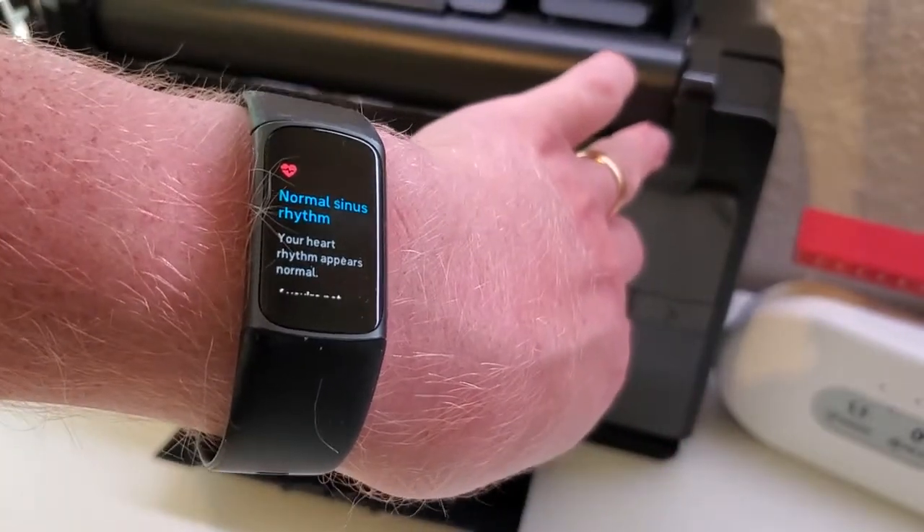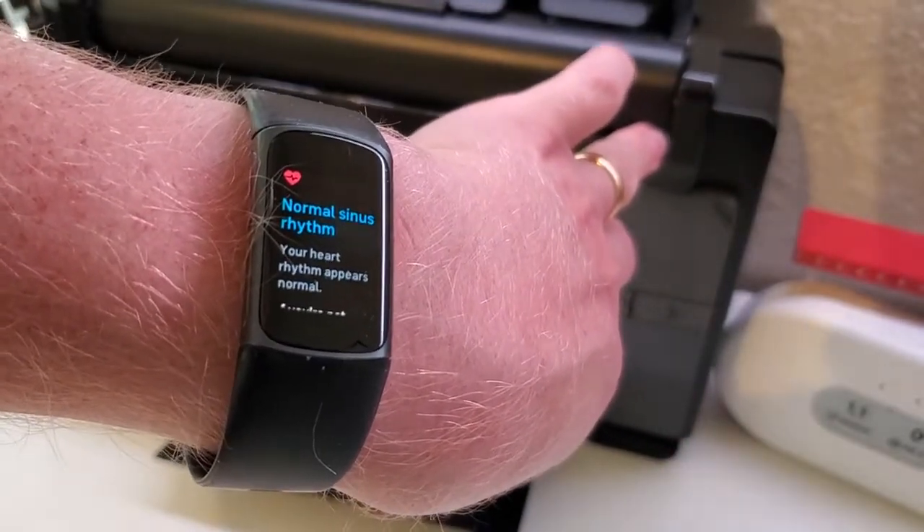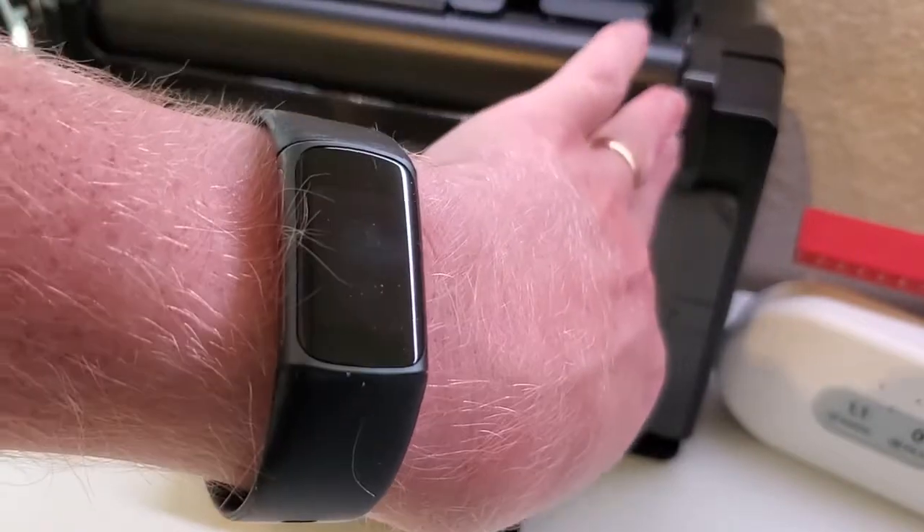You can get one of three different results. This is the good one: normal sinus rhythm. That means that the test was successful and it was able to determine that my heart rhythm is fine.